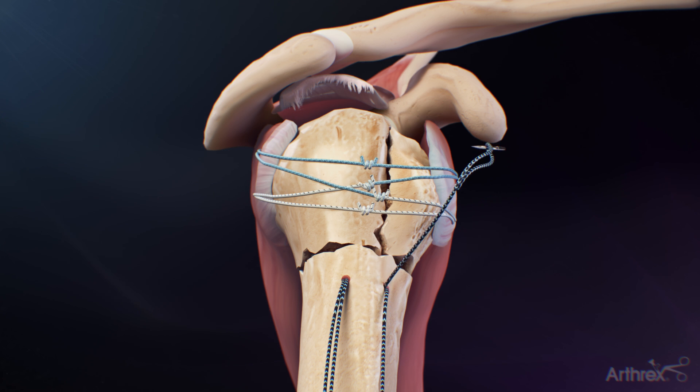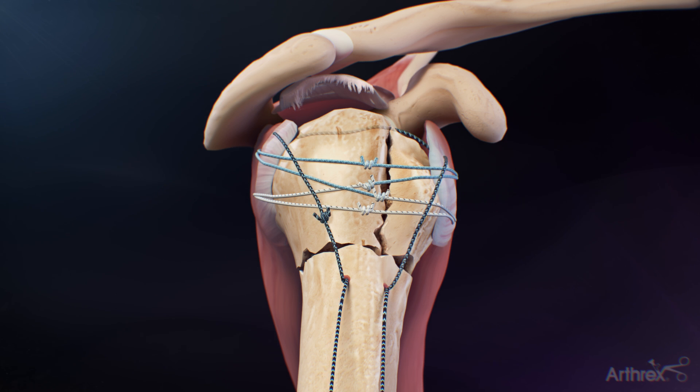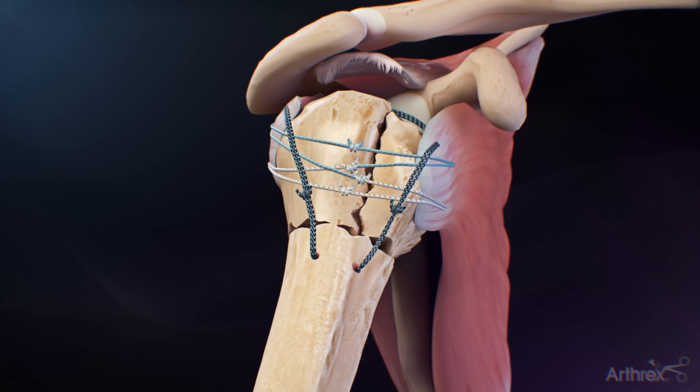Starting with the anterior hole, pass one limb of the black-blue fiber tape up through the superior aspect of the subscapularis and then through the superior aspect of the infraspinatus. Take one limb of suture from the posterior hole and tie it to the passed suture. Repeat the process for the remaining black-blue fiber tape, working posterior to anterior.